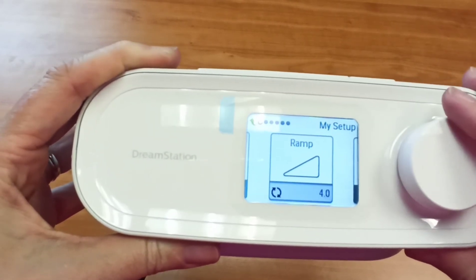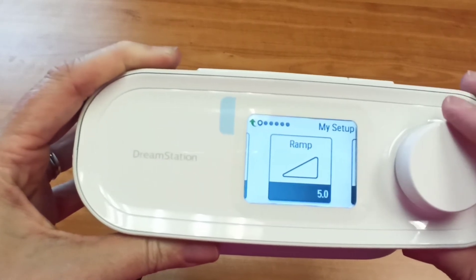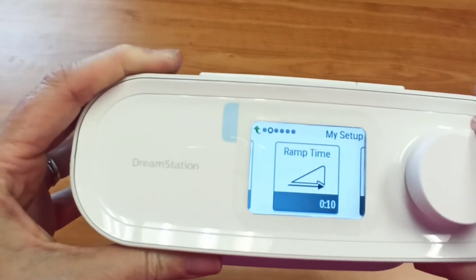So if you don't want it to drop so low, just hit your knob and turn it up a little bit. If you want it to climb faster, hit your knob and turn it down a little bit. Give it another click and now everything's saved.